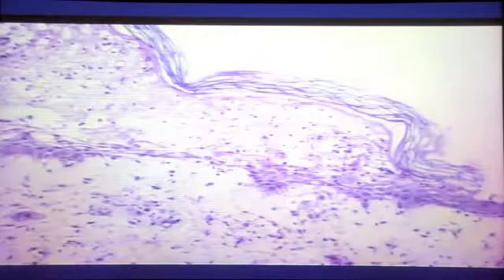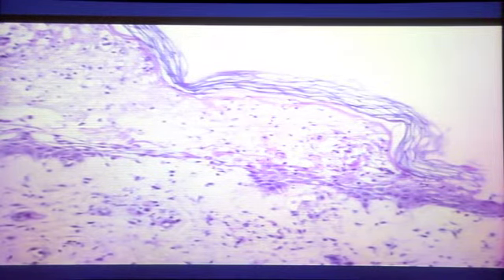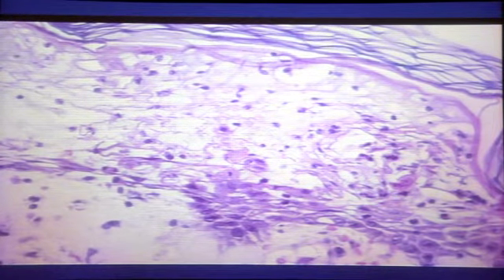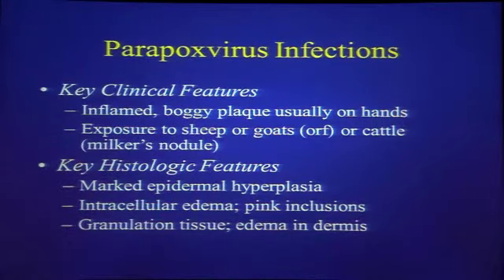Okay, now this does not have any intracytoplasmic or intranuclear inclusions, but this lesion generally tends to occur pretty quickly. You get the ballooning degeneration here with the overlying basket weave cornified layer, and you'll need to kind of correlate this with a history of sun exposure. And so this is what you see when you see these conditions like juvenile springtime eruption, hydroa aestivale, hydroa vacciniforme. They all kind of give you this same pattern of prominent ballooning with a variable infiltrate of lymphocytes and usually overlying normal cornified layer. I've already talked a little bit about this before in the first talk.